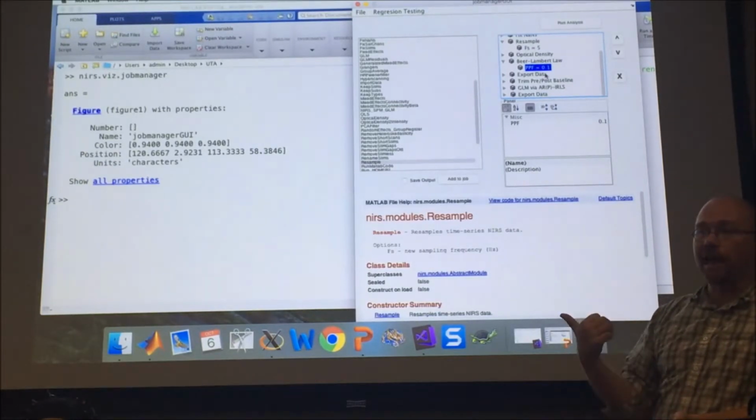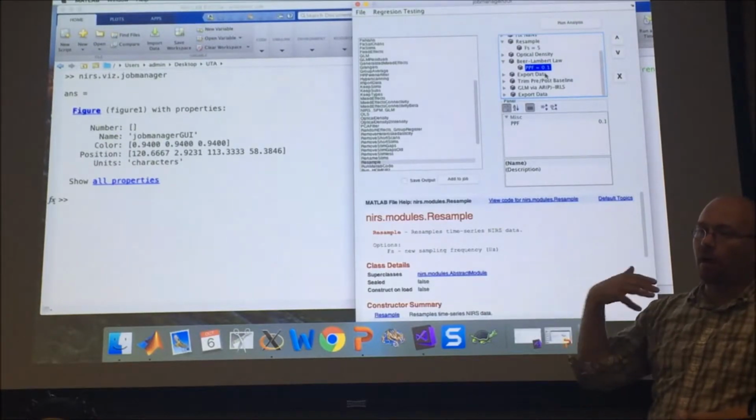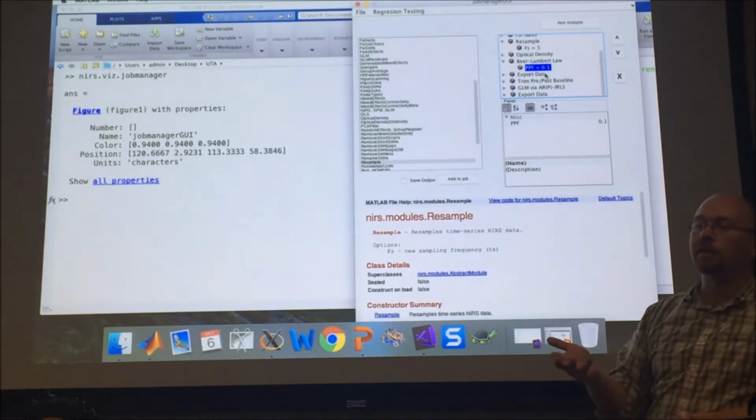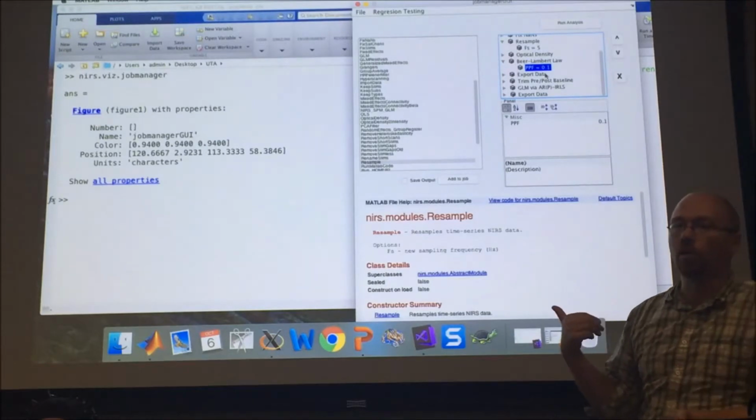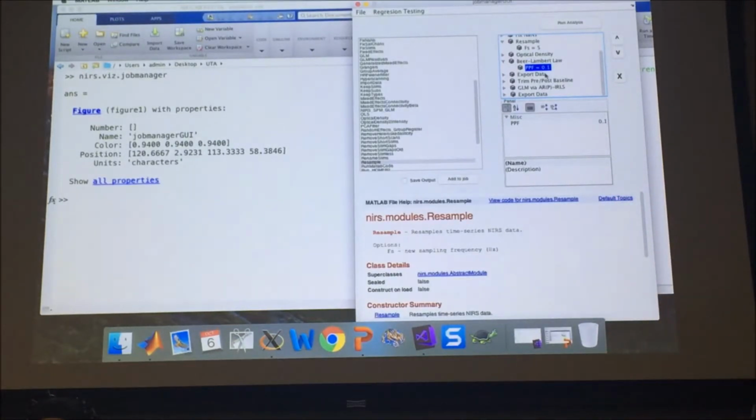But all of my stats, when I do it, because it's divided by it, it scales both the data and the noise. All my t-scores are unitless, and they don't care about DPF or this PPF term. So it's something to keep in mind when you think about interpreting whether these absolute magnitudes of signals make sense, but it doesn't actually end up affecting the statistics.